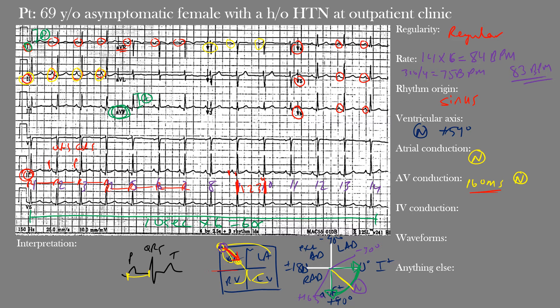For intraventricular conduction, we look at the duration of the QRS complexes. Normal QRS duration is between 70 and 110 milliseconds, or about two to three small boxes. The main thing we're checking for is whether the QRS interval is prolonged. We can see narrow QRS complexes here that appear within normal limits — the QRS duration is 80 milliseconds, confirming that intraventricular conduction is normal.